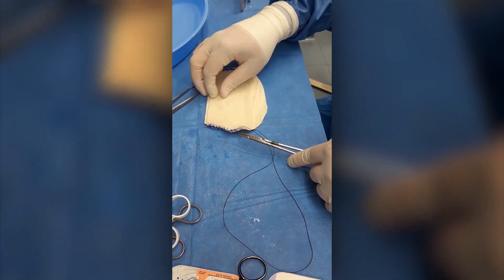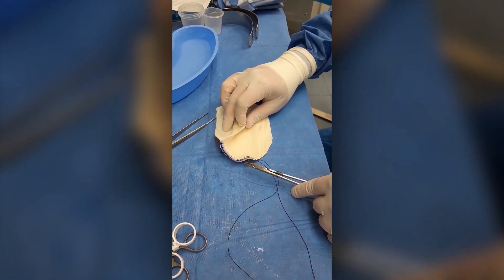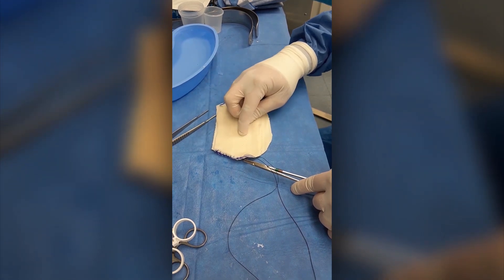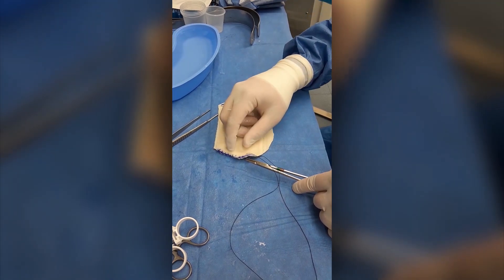So here we are. I've got these two pieces now set up so that the deep surfaces are facing each other. This is the smoother surface of the ADM and I'm going to sew this all the way around with a running continuous permanent stitch.